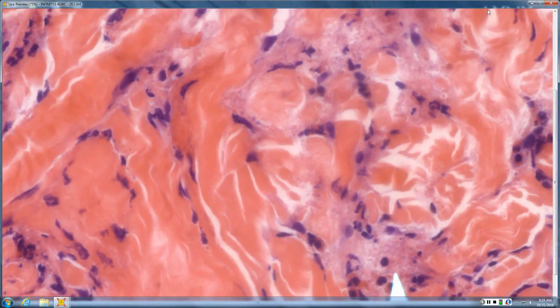But Wells is just a fancy name. Right? Love to hit that with a major basic protein stain. I would assume that would be a good thing to do, and it would be positive. Mark on this splotch. Okay. There's the treatment too.